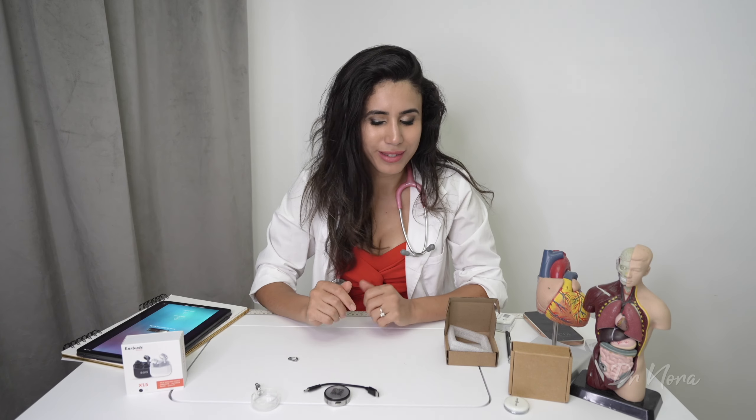Within the box you also get a few replacement covers, so if this part comes loose you can simply undo the plastic and replace it. So far so good — but what are the features of this Stemoscope?